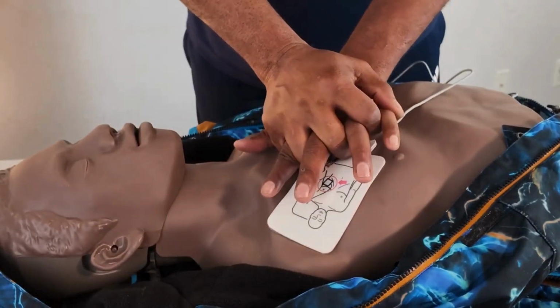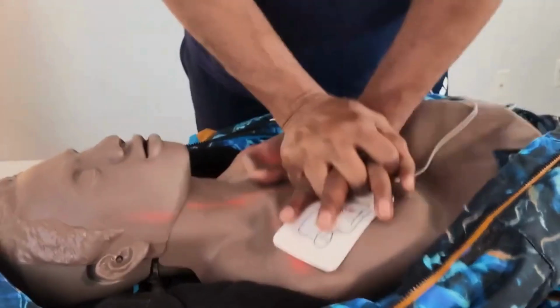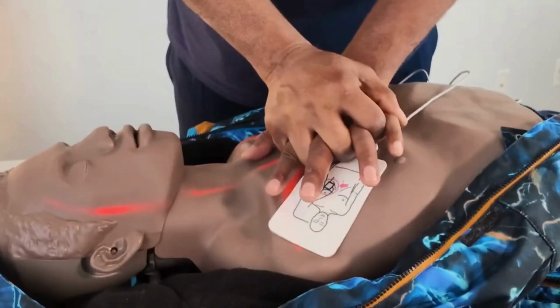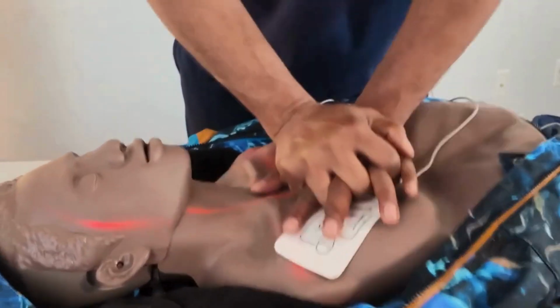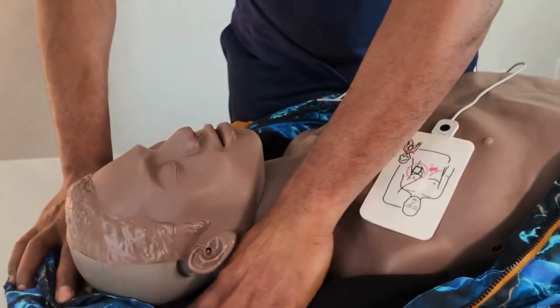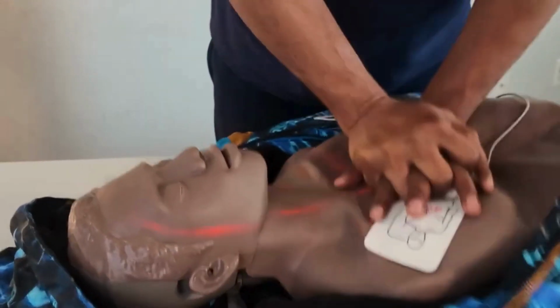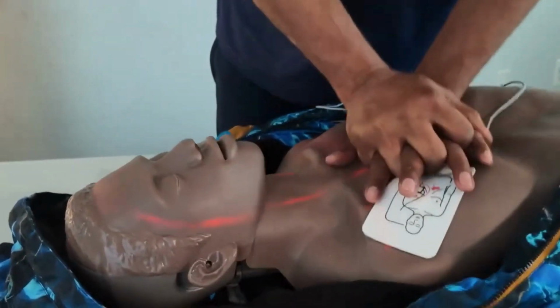Tap, tap, tap, tap. Continue CPR. Continue CPR.